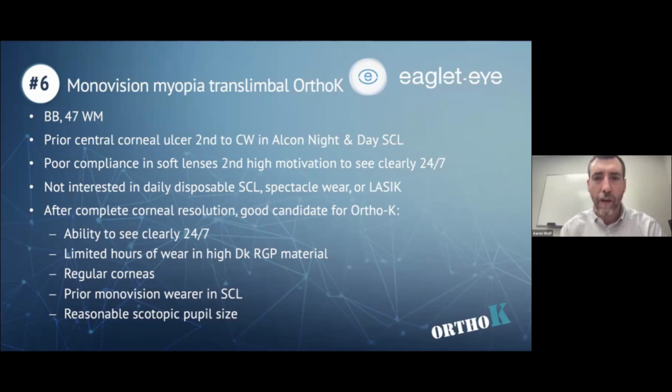This patient was a soft contact lens wearer for a long time, and they were wearing their soft contact lenses continuous wear. Continuous wear meaning that they essentially weren't ever taking them out for several weeks at a time. They had been doing this for a long time because they were in a soft contact lens that had been approved for that 25 years ago almost at this point.